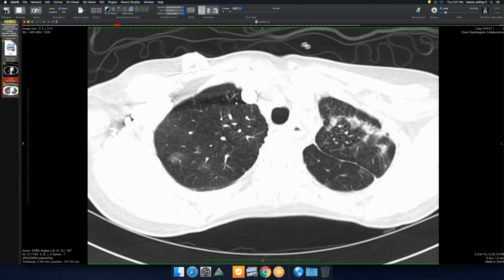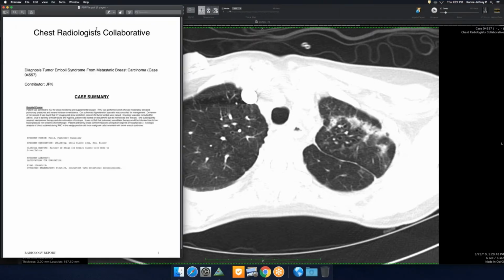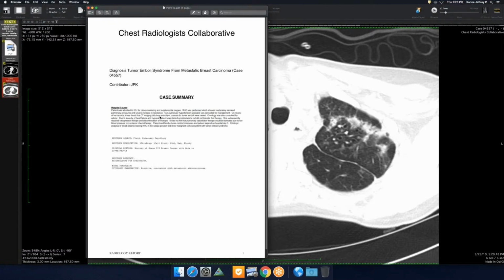Let's see, I actually have a report here. Oh, here, you can see that. So, right heart cath. Oh, I remember now. When they did the right heart cath, they actually took some blood out, and you can see it had positive cytology.